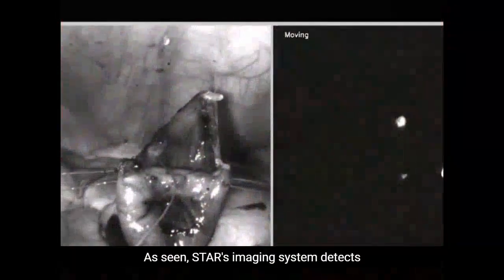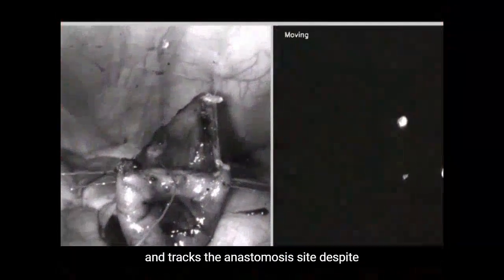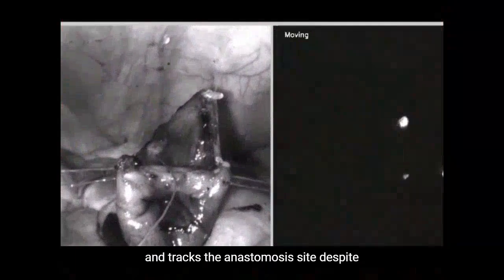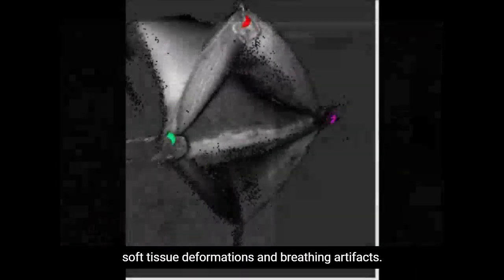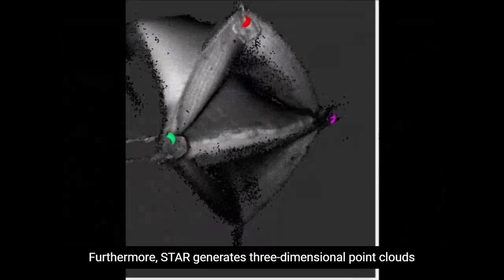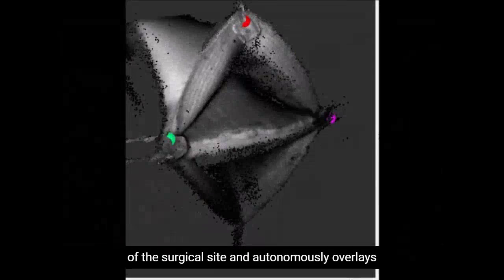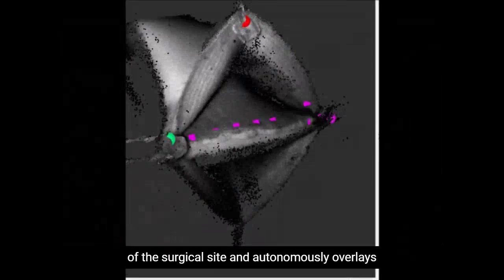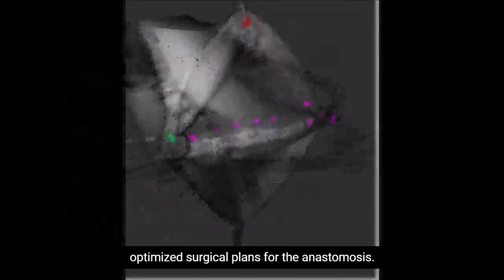As seen, STAR's imaging system detects and tracks the anastomosis site despite soft tissue deformations and breathing artifacts. Furthermore, STAR generates three-dimensional point clouds of the surgical site and autonomously overlays optimized surgical plans for the anastomosis.